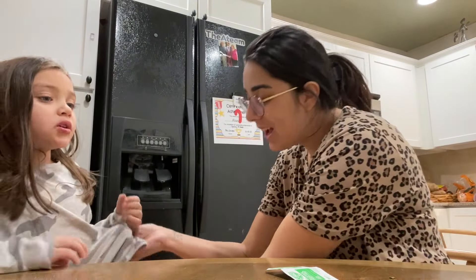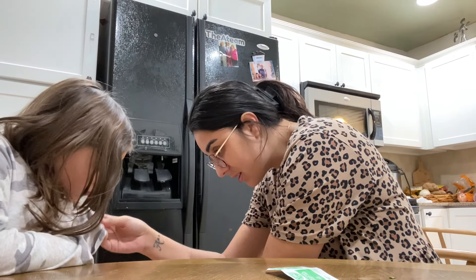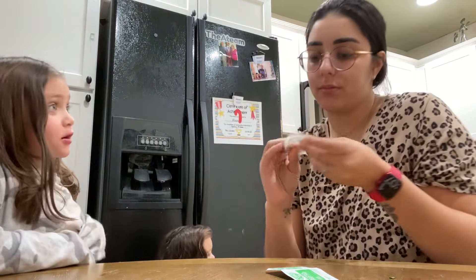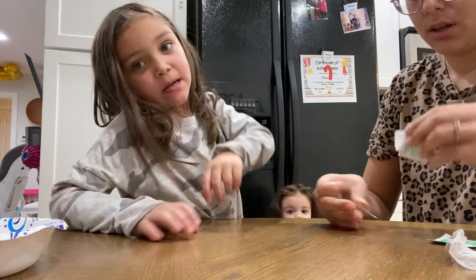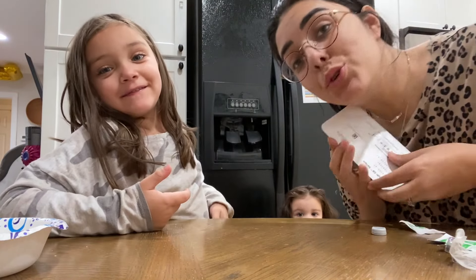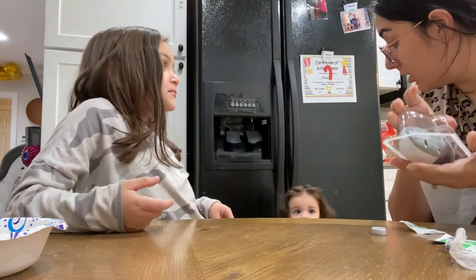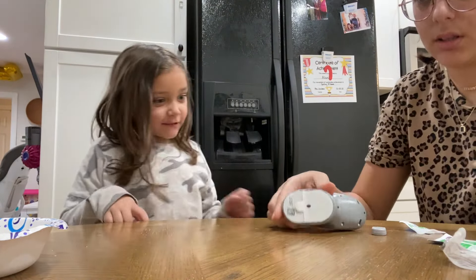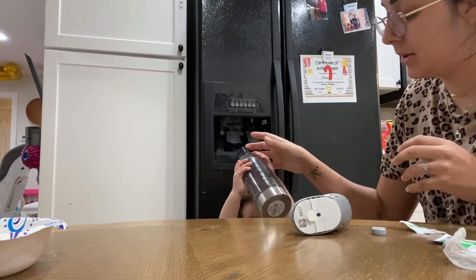Hi guys, we are doing a quick Dexcom change on Miss Alana. Okay, take this one — hold this. There we go. That didn't hurt — it really didn't hurt. So tell the team what today is. It's Christmas? No, today is New Year's Eve, so tomorrow is a new year. Thank you, Alana.